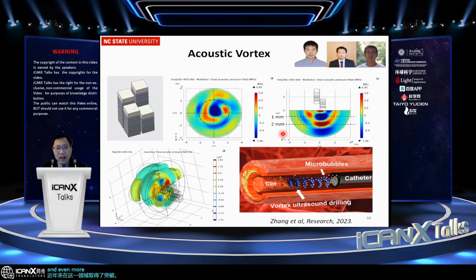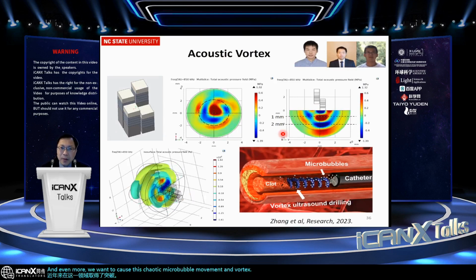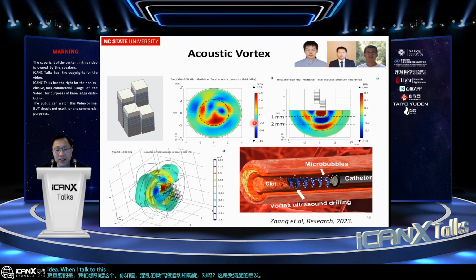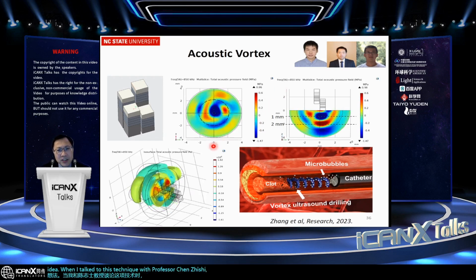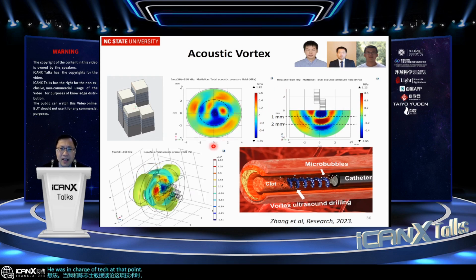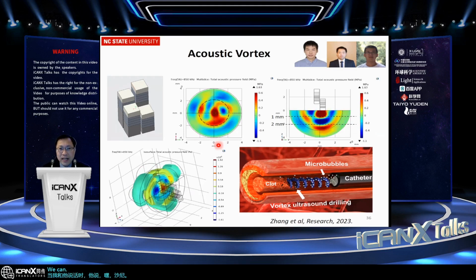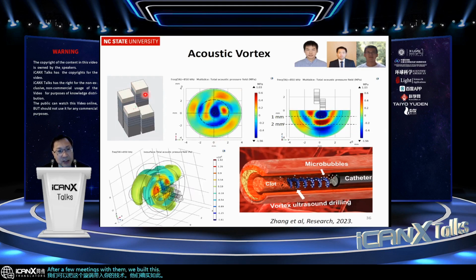And even more, we want to cause chaotic microbubble movement and a vortex, right? That is inspired by the vortex idea. When I talked about this technique with Professor Chen Zhi Lao, who was at Georgia Tech at that point and did a lot of acoustic vortex work, he said, "Hey, Xiaoning, we can bring this vortex into your technique." And indeed, after a few meetings with them, we built the first prototype.